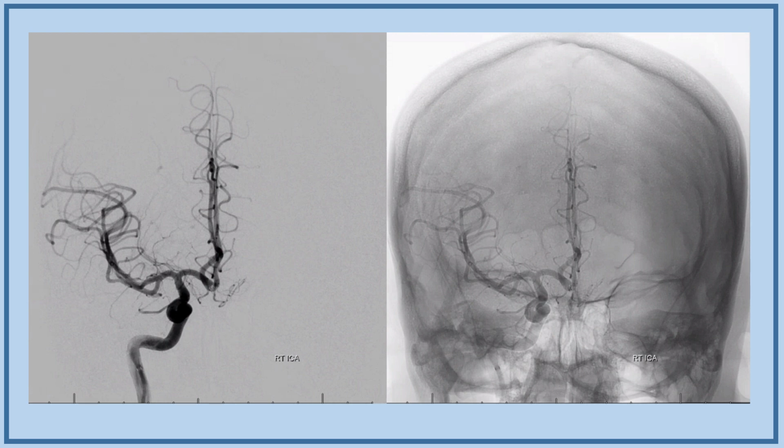And I think it's very important to see that the technology exists for us now to make this kind of embolization not only achievable, but reasonably safe. And again, we've had these discussions. We have some excellent surgeons on all sides, and so there's more than one way to skin this cat. But I think an endovascular way ultimately is the way that the world is going. So if you can skin it this way, that's what you're gonna do. So that's it for this case.